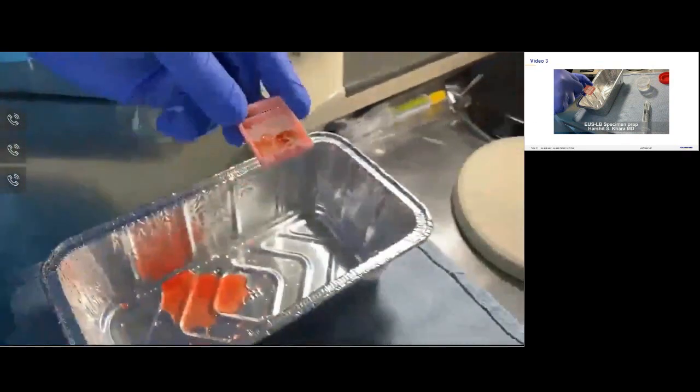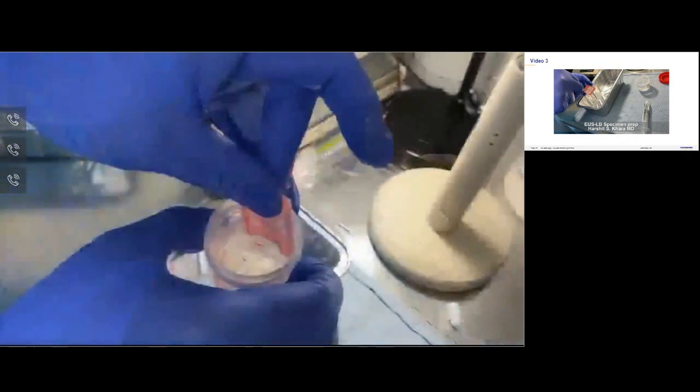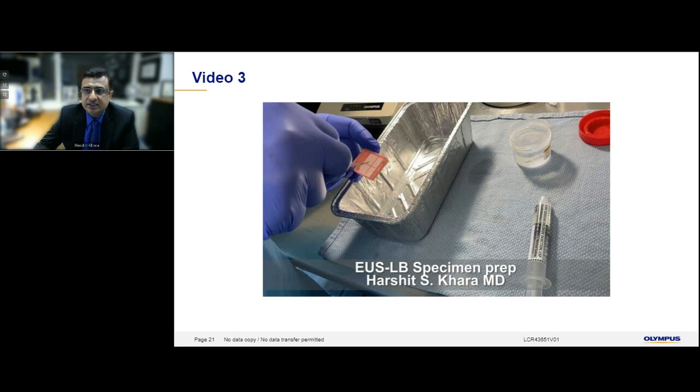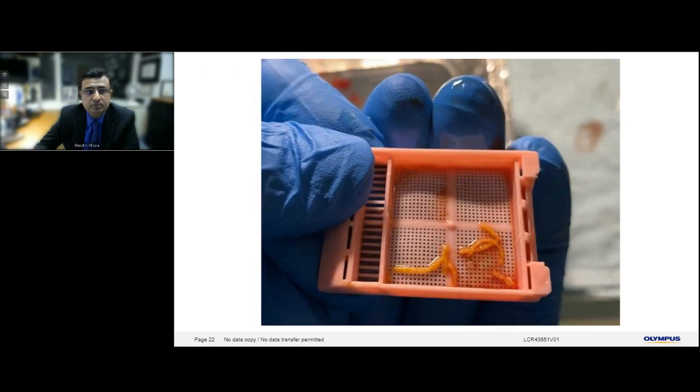And as you can see, all the water and the blood falls into the silver pan below, and we're able to get pure liver cores right in the formalin cup. So this is sent not as a cytology specimen. These are tissue cores sent as histopathology specimens.